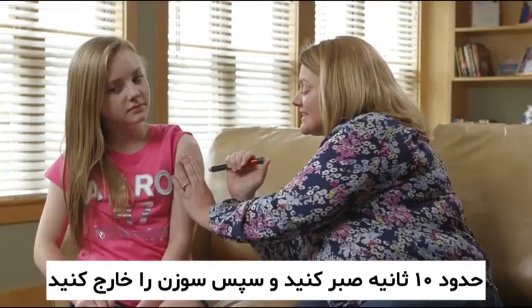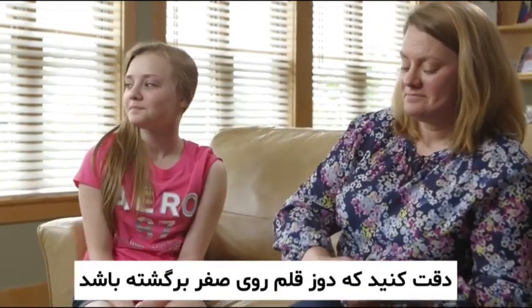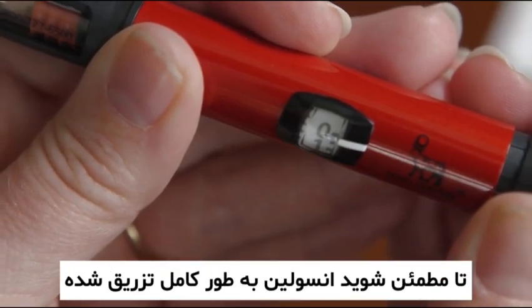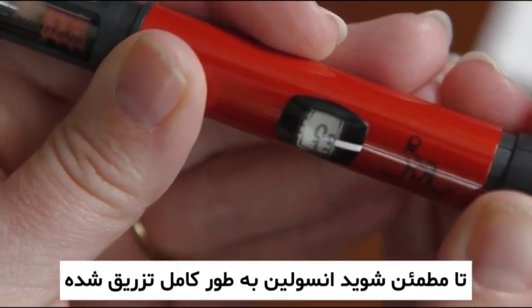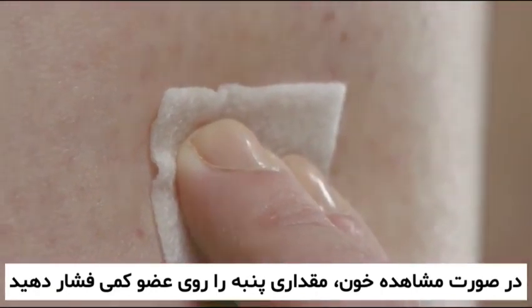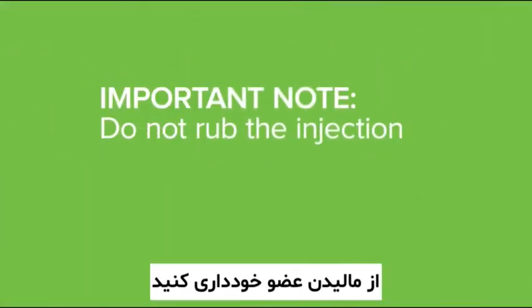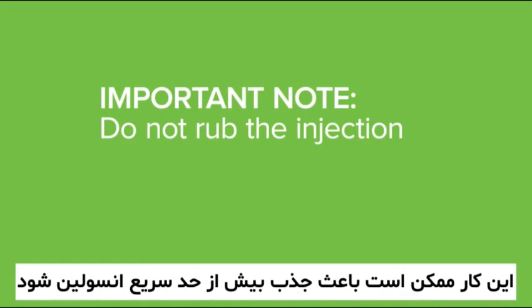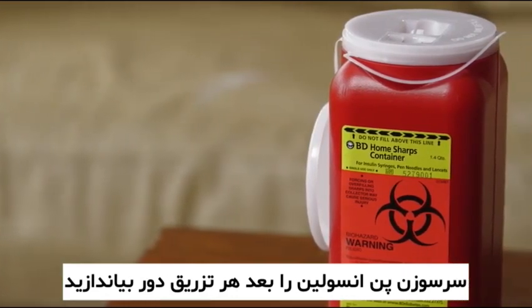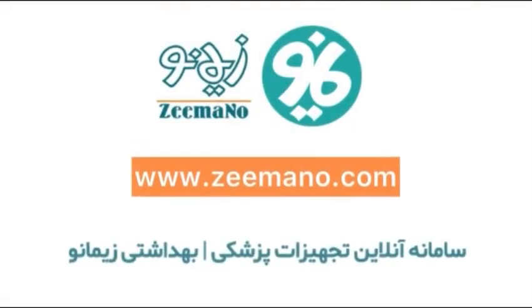Count for 10 seconds before removing the needle from skin, confirming you see a zero in the dose dial window. If slight bleeding or stinging occurs, you may apply slight pressure. Do not rub the injection area as this may cause insulin to be absorbed too quickly. Remove the pen needle after each use and discard into a sharps container.